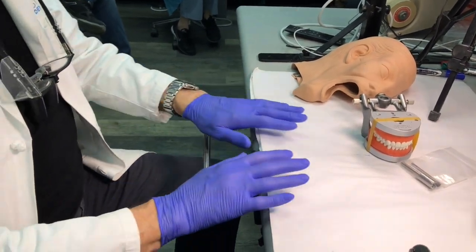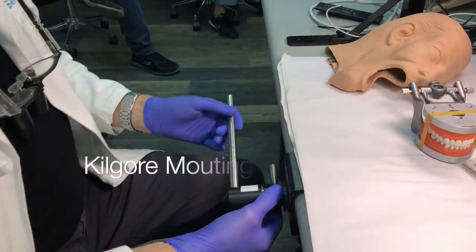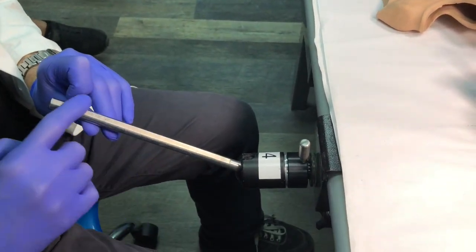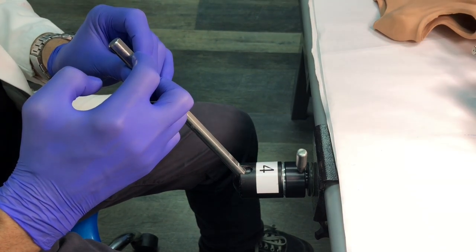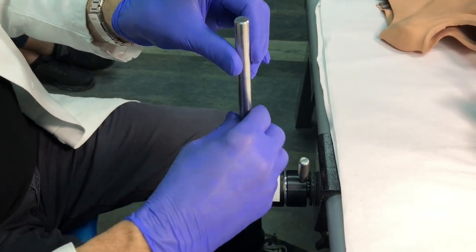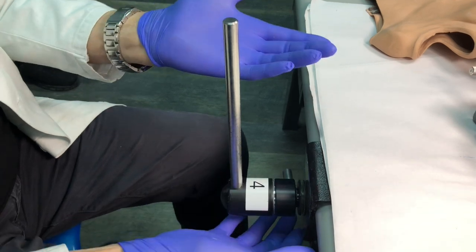We're going to talk about ergonomics on the bench. This is our version of a simulation system — this is the Kilgore pole. You loosen the pole by going one direction, and you'll notice it has a flat end. The flat end is meant to be where the screw on the typodont goes, which keeps it from rotating. You can move it up, turn it, rotate it — you can basically get any position you like. It's very versatile.